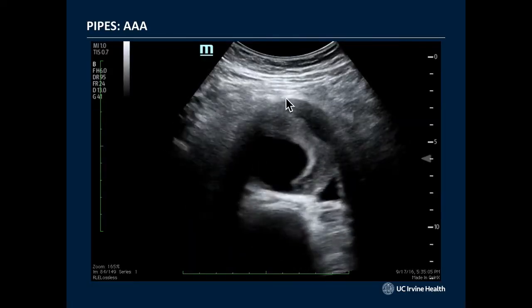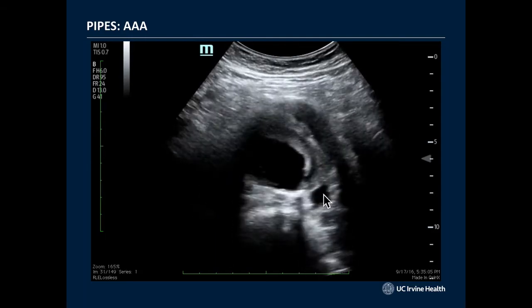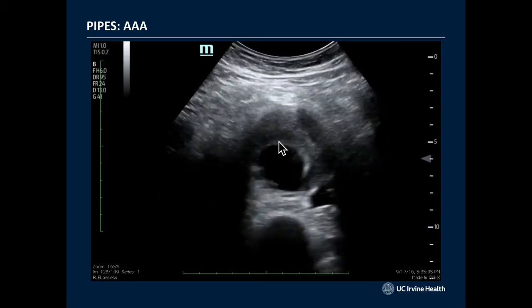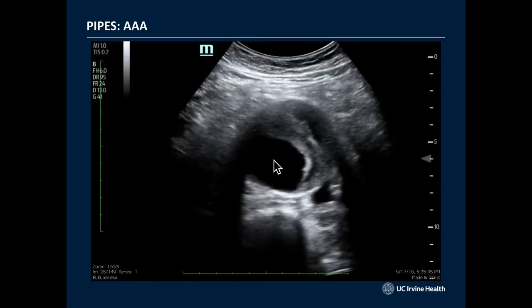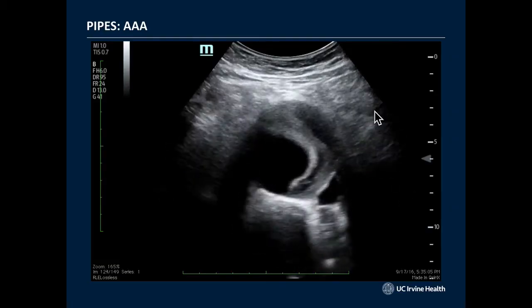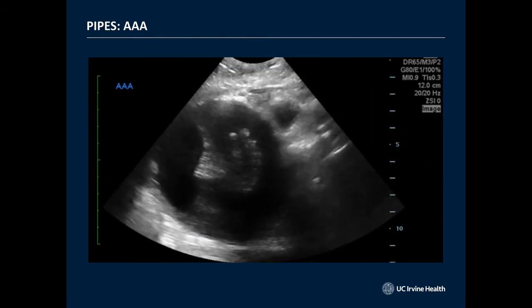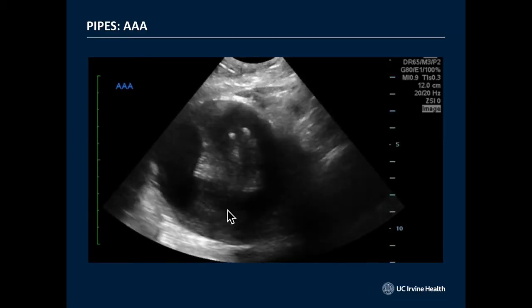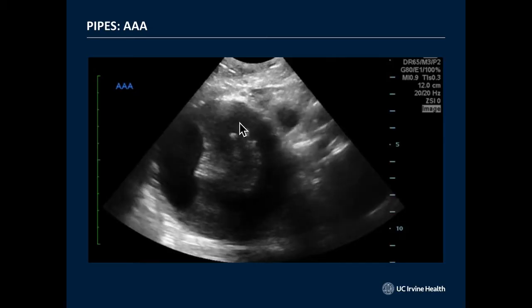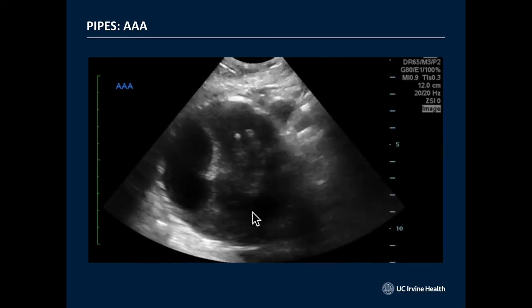This here is another example of an abdominal aortic aneurysm. You can see the aorta is here. There's some mural thrombus over here blocking that pulsatility that you would expect to feel in the physical exam, which you don't, because of all this mural thrombus here, dampening the pulsatility of that AAA. All right, here's another AAA here. Big aneurysm all the way. I would measure from here all the way to here. Here's the lumen. This is all that mural thrombus here that's so common in these AAAs. And so, yeah, they get pretty big like this.